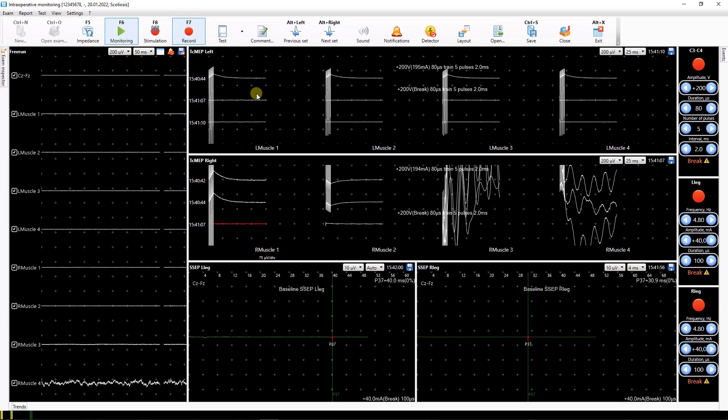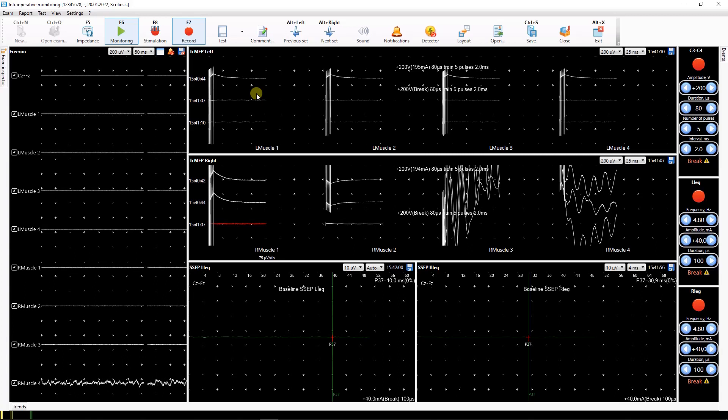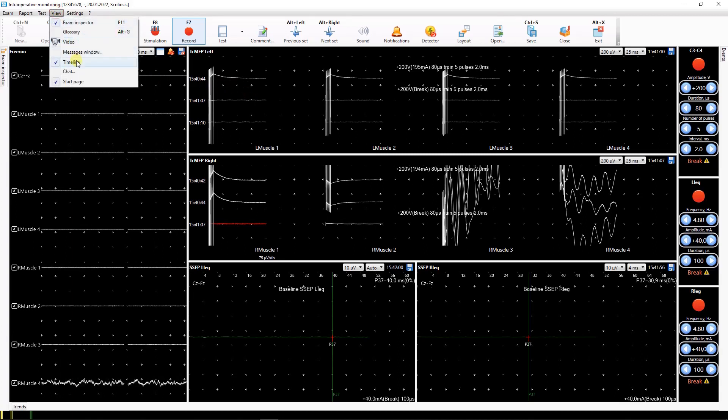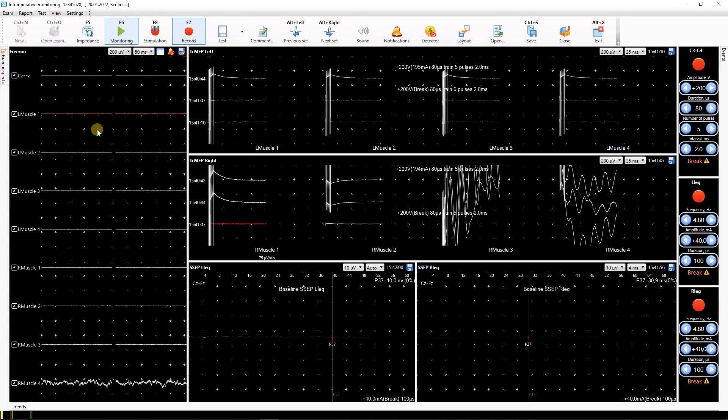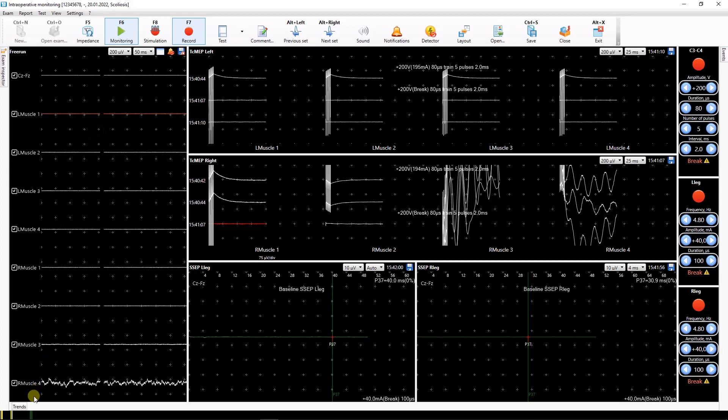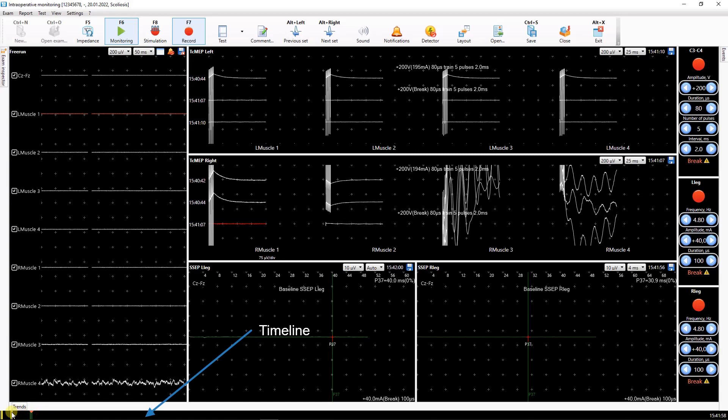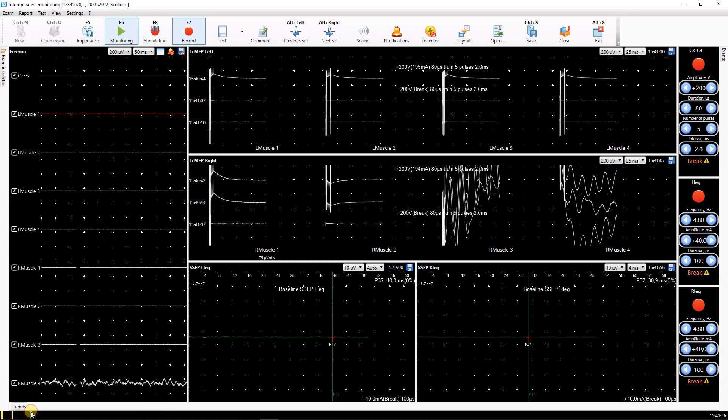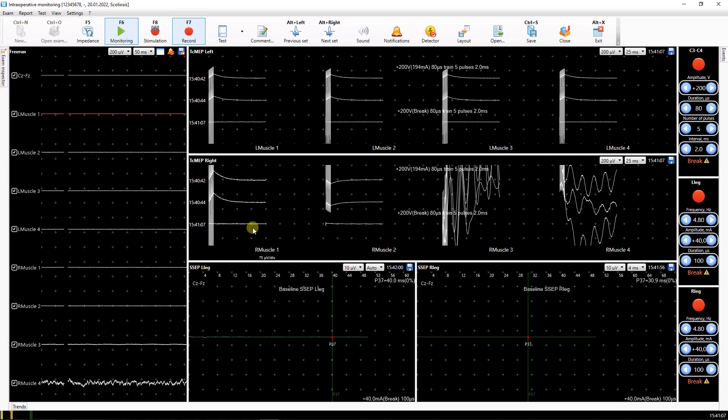To navigate over the data recorded during monitoring, use the timeline control. To activate it, use the view timeline main menu command. All recorded traces are displayed at the bottom of the screen. To go to the required trace, you just need to click on the corresponding stroke.